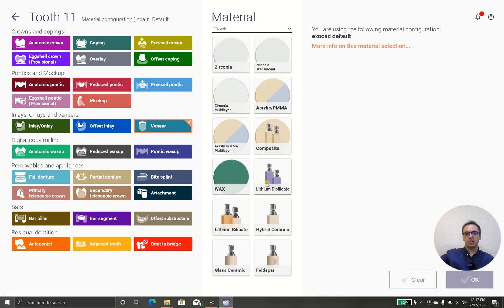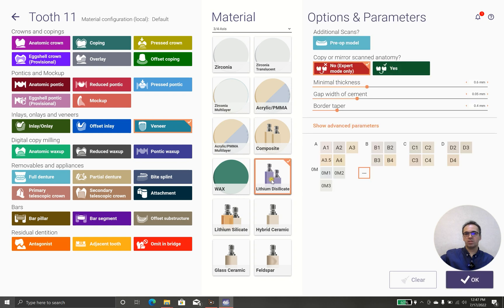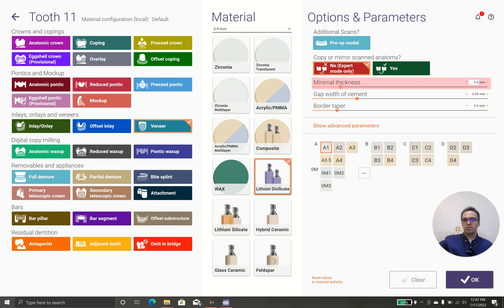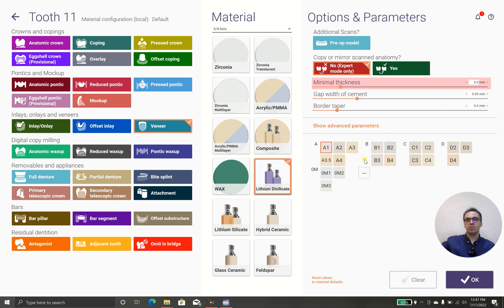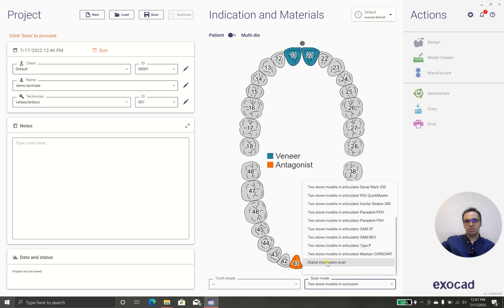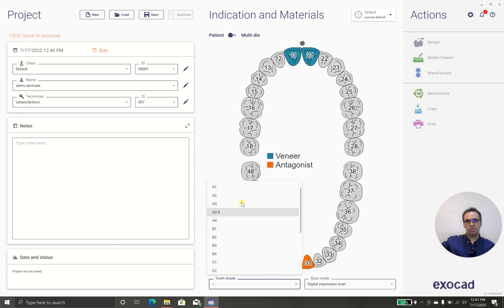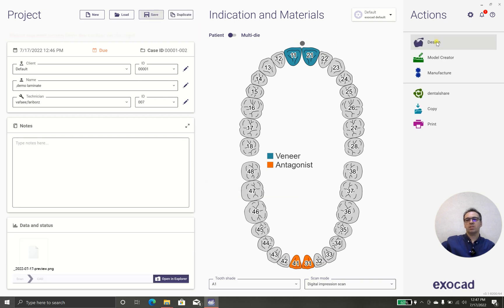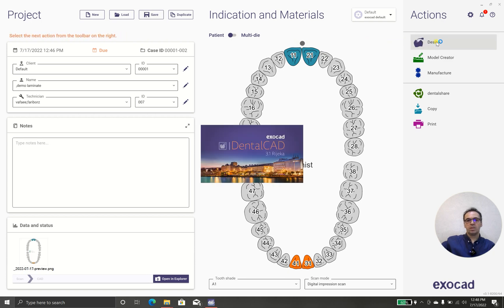I'm going to use lithium disilicate with color A1 and I don't have pre-op model. Minimum thickness 0.4 because in my clinic we are using Ceriona InLab MC XL and it can mill with a 0.4 without chipping of edges. Gap 50 microns, that's okay. Border taper 0.4, that's okay, and of course it's four axis. Let's scan mode digital impression to shade A1, I will save it. Okay, let's go for design and let's check how we should design a proper laminate veneer.